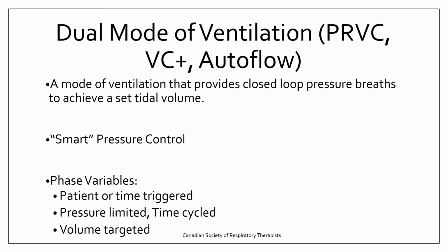You're delivering pressure-controlled breaths, so maintaining a constant pressure throughout the breath. Because we're maintaining that same pressure throughout the breath, it's a bit more comfortable for the patient. It works the same way as pressure control does, where we have this constant pressure throughout the breath. So pressure is constant, like so. And then we have this nice flow decay that occurs. And that's a bit more comfortable for the patient than volume control ventilation, where we have this increasing pressure gradient throughout the breath and a constant flow. So having that constant flow throughout a breath isn't very comfortable.